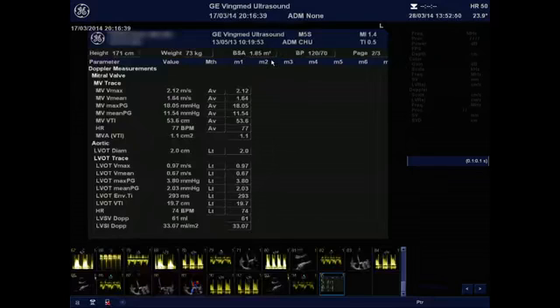And in that case, if you do so, you will obtain an indexed effective valve area of 0.59. So you're facing a case of severe patient prosthesis mismatch. For a mitral valve prosthesis, you have a severe prosthesis mismatch when the indexed effective valve area is under 0.9. And for an aortic valve prosthesis, you have a severe mismatch when the indexed effective valve area is under 0.65.